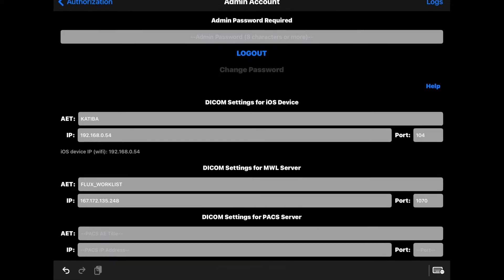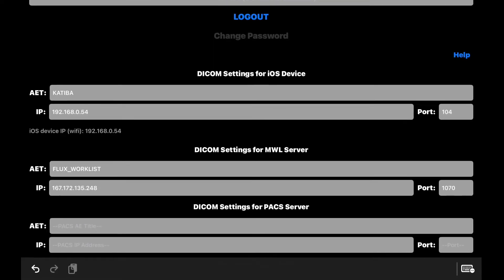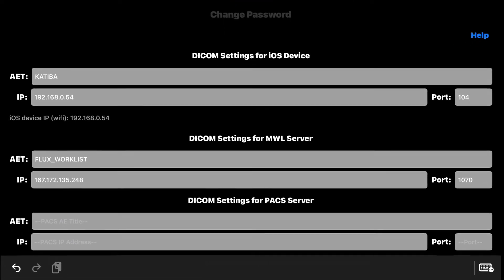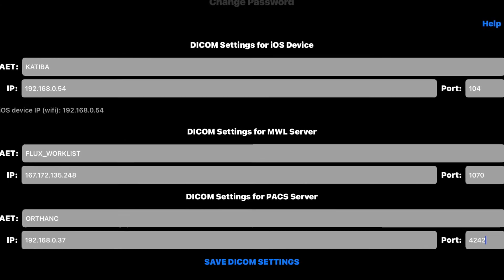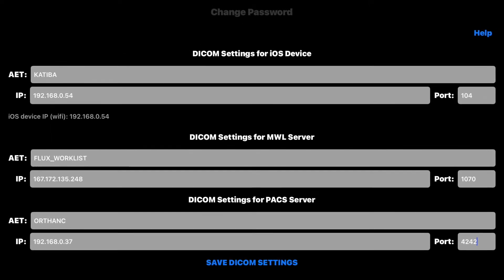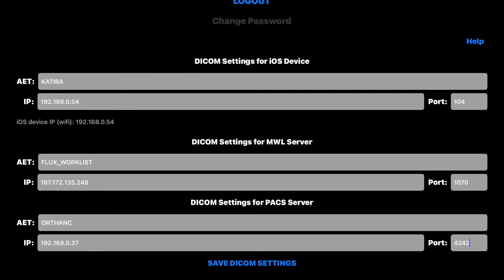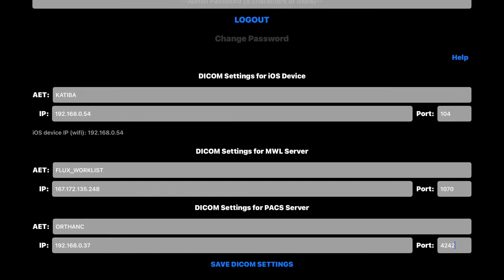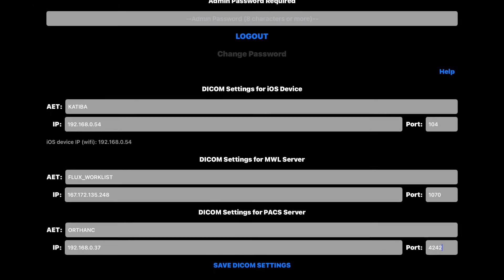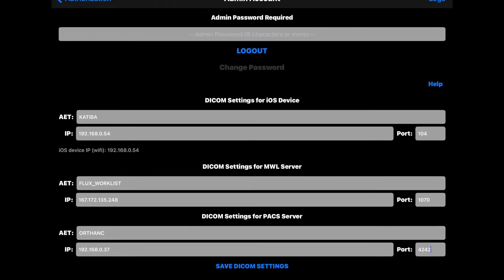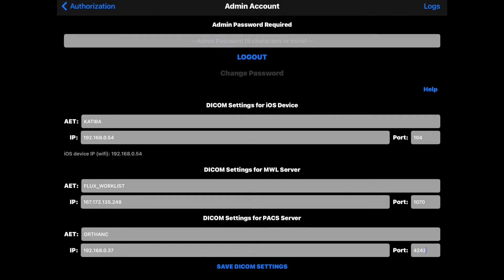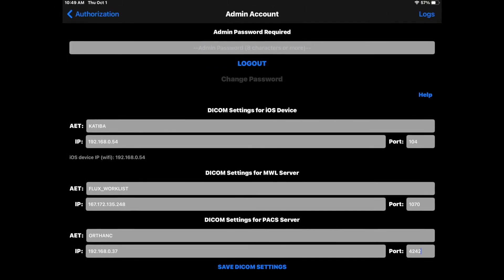Enter the AE title, IP address and port for your modality worklist server. Enter the AE title, IP address and port for your PACS server. You will need to register the title, IP address and port number of your iOS device on your DICOM servers as well.